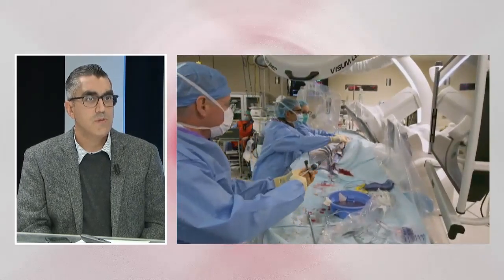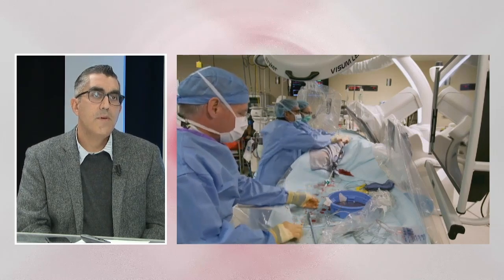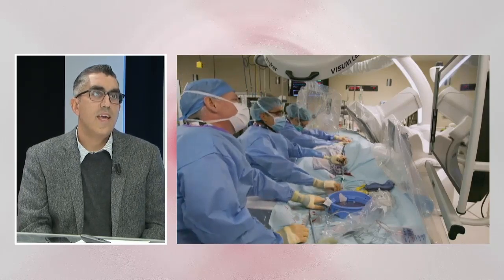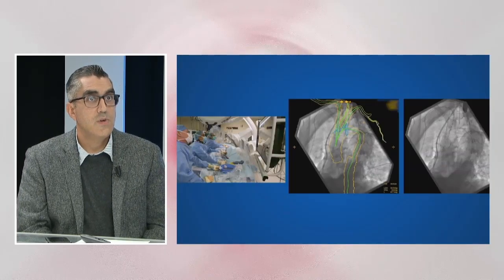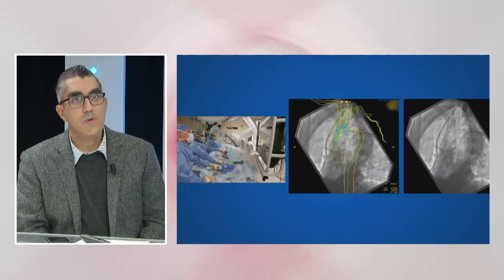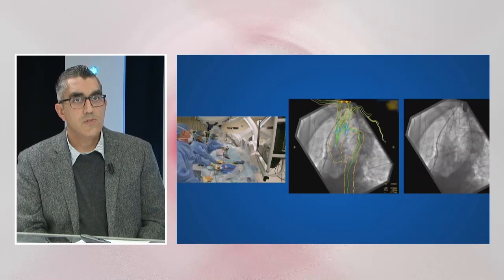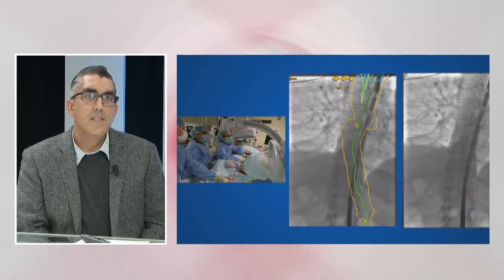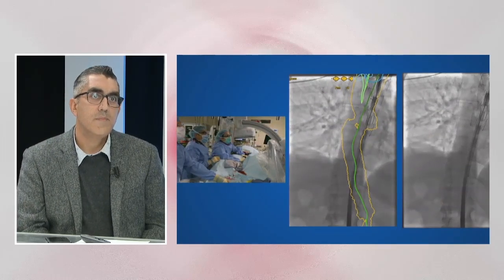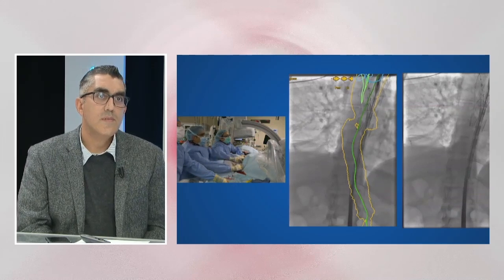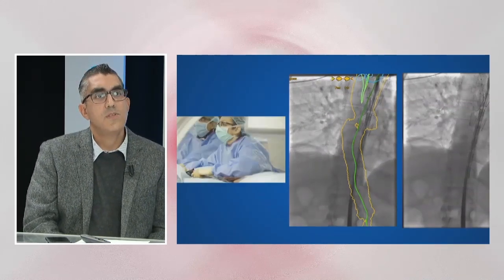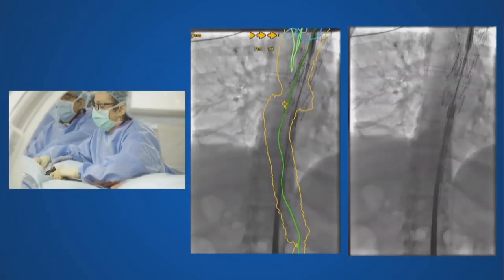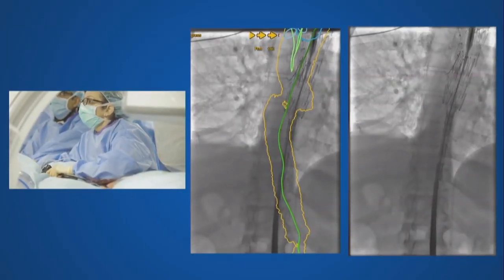The final device will be a bare metal stent. You can see our obliquity — the patient needed a 66-degree angle, and the machine can really achieve those angles to outline the arch vessels. You can see our second device going in, followed ultimately by the bare metal device. In this more AP projection, our system is still spot on with regard to how far down we need to cover. Most of this was planned preoperatively.